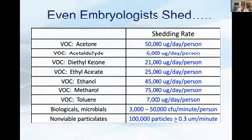This is actually a publication not on embryologists, but on an OR tech in scrubs, hats, booties, and mask, similar to what embryologists wear. And they actually documented the significant shedding or production of VOCs, as well as biologicals and non-viables.